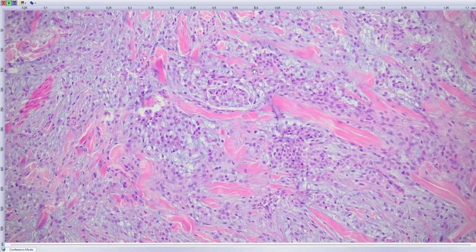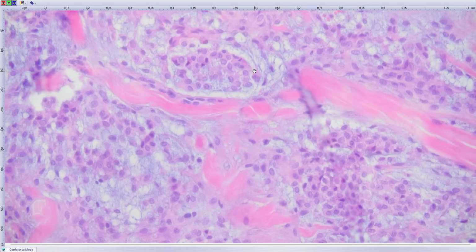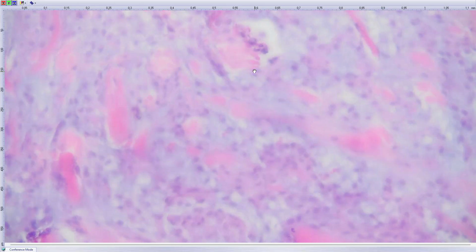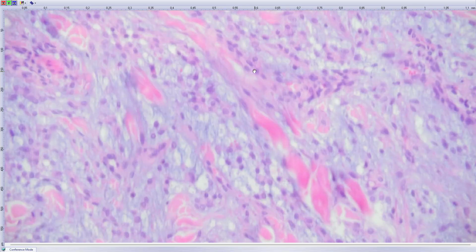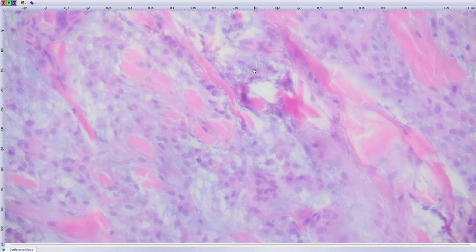One could even say it might be low-grade malignancy or whatever. And whatever you try, SOX protein, cytokeratin, all of them are negative. The only positivity is CD138. It is the only positive staining.